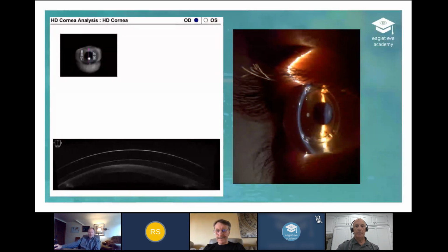Tiffany asked, how accurate do you find the haptics are in the algorithms? Very accurate. And again, Reinier has made these algorithms. By looking at post lenses, he's done some small tweaking, but you think about a Zen lens where each step is only 30 microns. So in the case we talked about before, it said steep 4, steep 10. I went steep 4, steep 9. Would it have looked any differently with steep 10? Probably not. You've got to really make some big changes, 100, 200 micron difference, to see those out there, but it's very accurate between those.